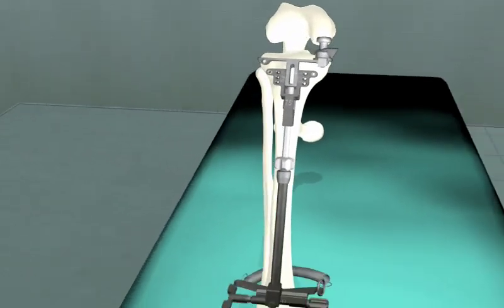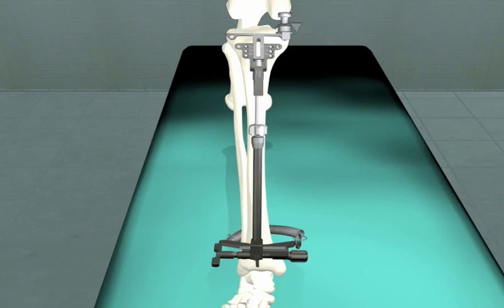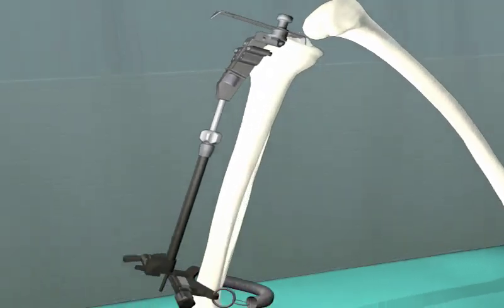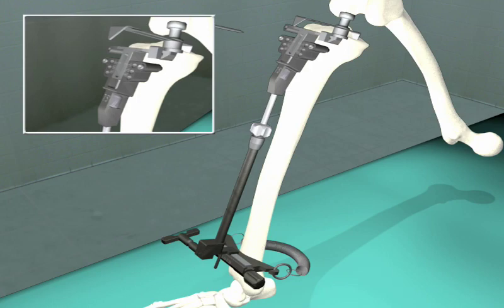The guide can be positioned medial laterally in the distal plane using the micrometer type guide. The guide itself can be moved anteriorly and posteriorly to get the desired posterior inclination angle, which lies between 5 and 10 degrees. The guide is then pinned into place.